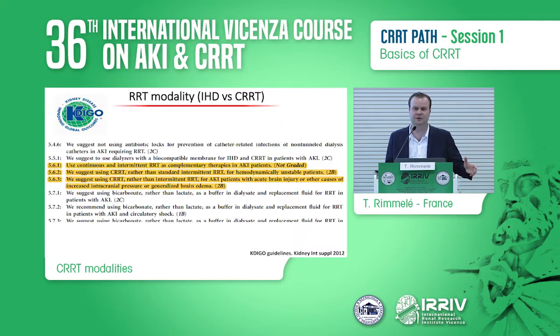So having said that, when you look at the KDIGO guidelines, the international recommendations, they tell us to use CRRT and intermittent hemodialysis as complementary therapies, but we should prefer CRRT in case we have hemodynamically unstable patients, and as I said before, in case we have acute brain injury.